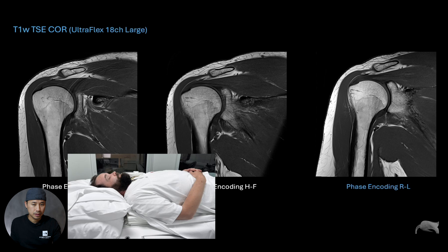This is the very common positioning: you have the shoulder coil, the patient is lying inside the shoulder coil — in this case for the right shoulder — and behind there is just some cushion and the patient is lying flat. These two images were done like this, which is the standard routine — it's what everybody taught me when I was starting with MRI.